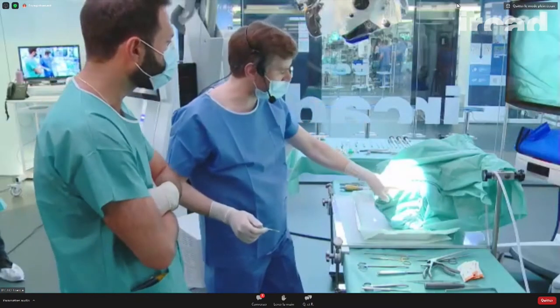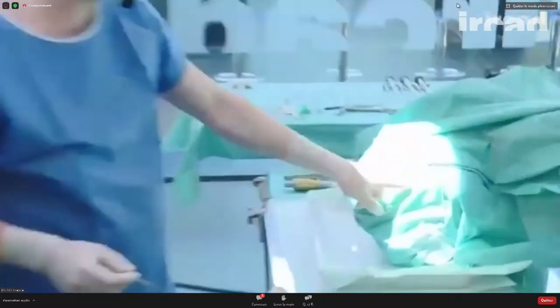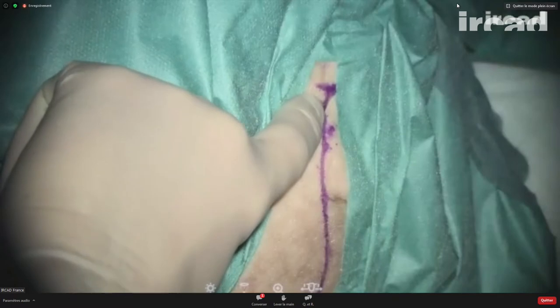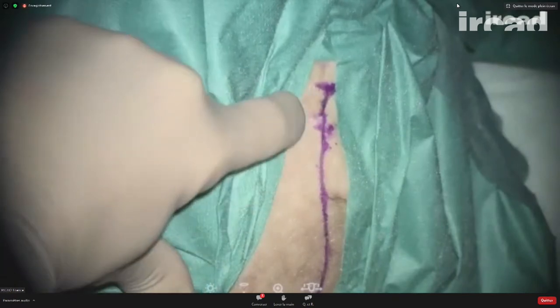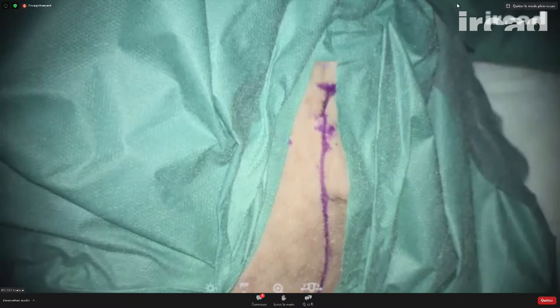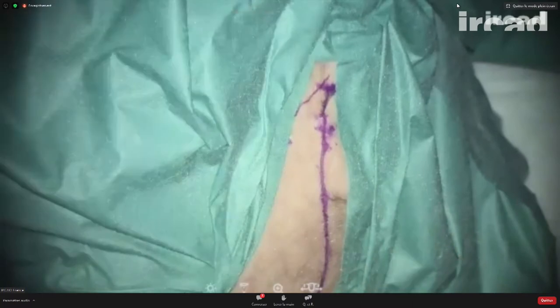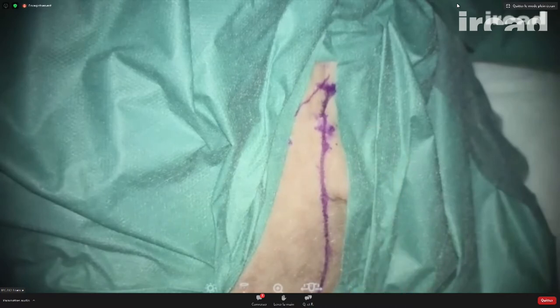The tragus is around here, so you can go lower to the tragus, but the incision must stay as posterior as possible along the tragus. It should not be too anterior, otherwise you may injure the frontal branch, which is probably around here. So the lower you go, the more posterior you should be with the incision at the lower aspect.